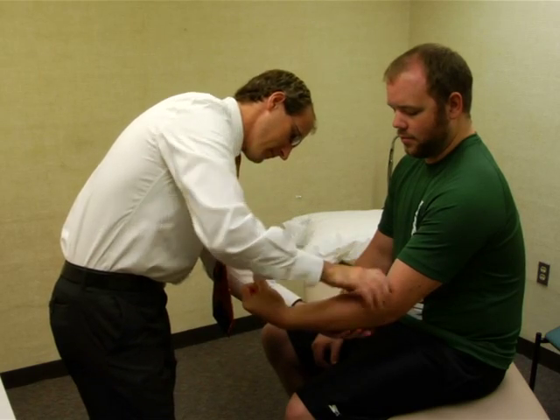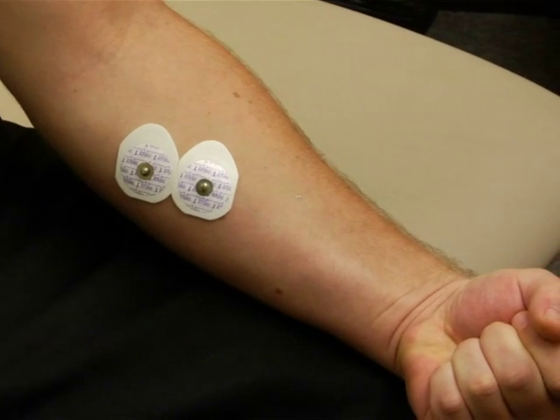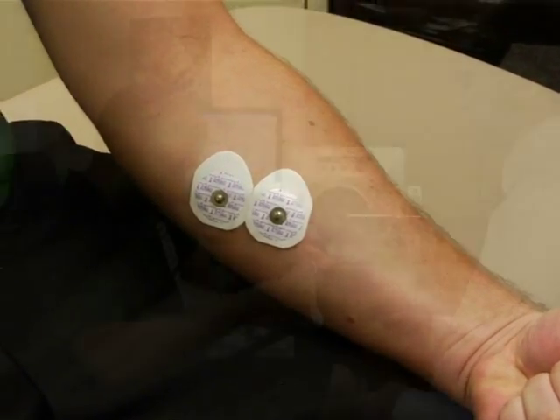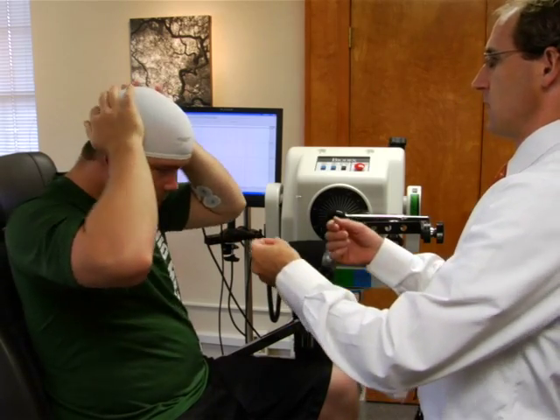Next, place surface electrodes over the subject's FCR muscles on the forearm using a bipolar electrode arrangement. Electrodes should be located longitudinally over the muscle on shaved and abraded skin. Also place a Lycra cap to mark stimulation locations on the head.